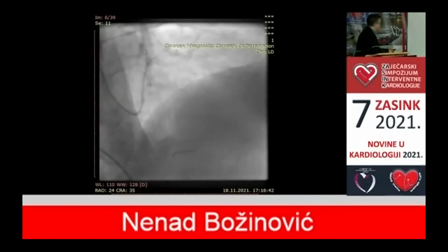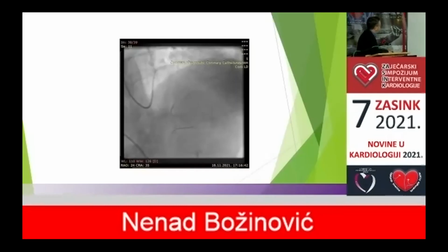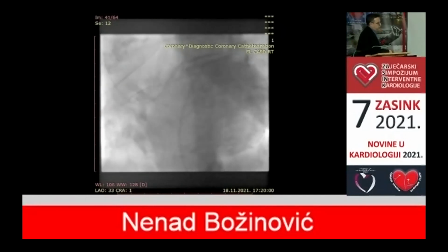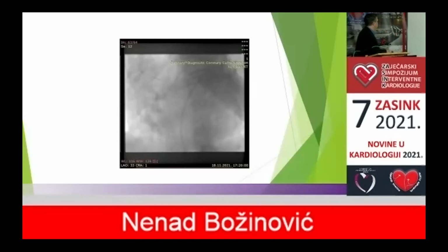this is a result of septal surfing through the first septal, and I reached the distal bed of the right coronary. And this is simply retrograde wire crossing, because this is not so long a CTO period, I think 7 or 8 months. This lady has had an acute myocardial infarction on the right coronary.